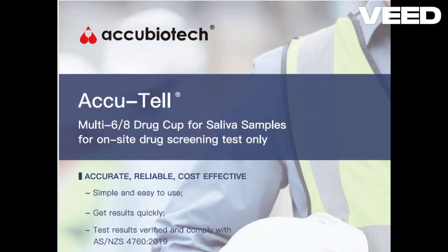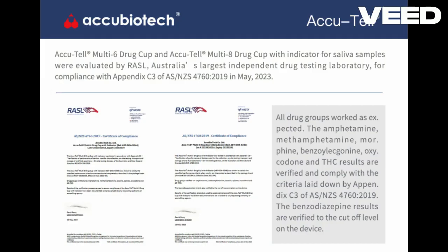The Accutel oral fluid test device is a screening point of collection test used to screen consenting donors for the presence of prescription and illicit drugs. The test is CE marked and is used extensively in Australia and New Zealand. Approved for use and complying with their strict standards of traceability and efficacy.